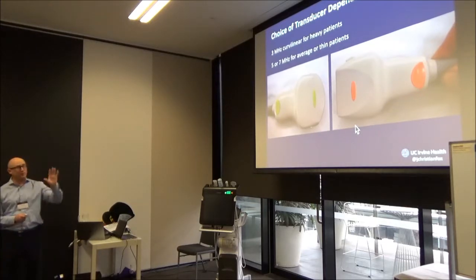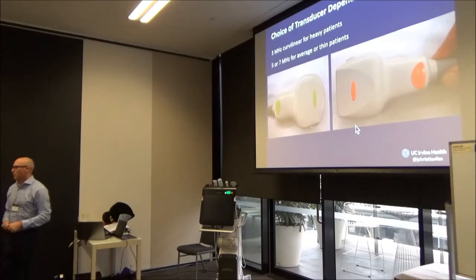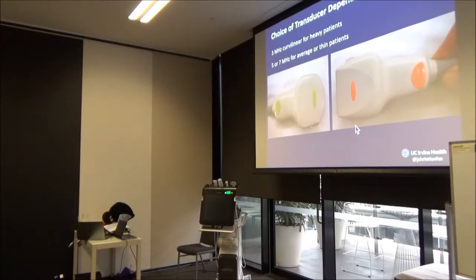In the linear case for the appendicitis. For the curved transducer, that's really where I start looking for small bowel obstructions. So I usually start with that curved transducer.